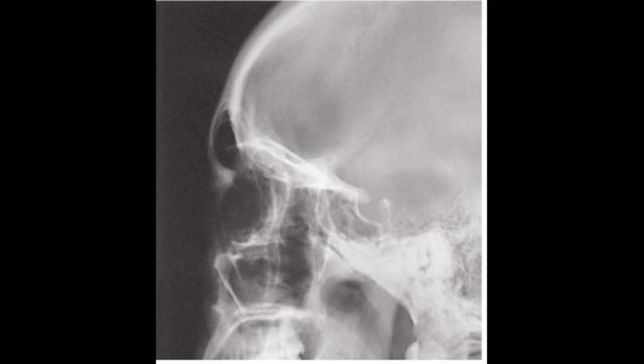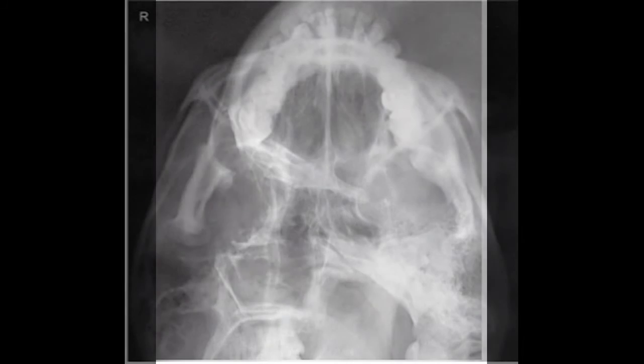There's no rotation or tilt of the sinus anatomy, and I can tell by looking to check that the sella turcica is in profile, that the orbital roofs are superimposed, and that the mandibular rami are also superimposed. The contrast and everything looks pretty good, and I would be easily able to see if there were any air fluid levels, if there were any. So this image is sufficient.